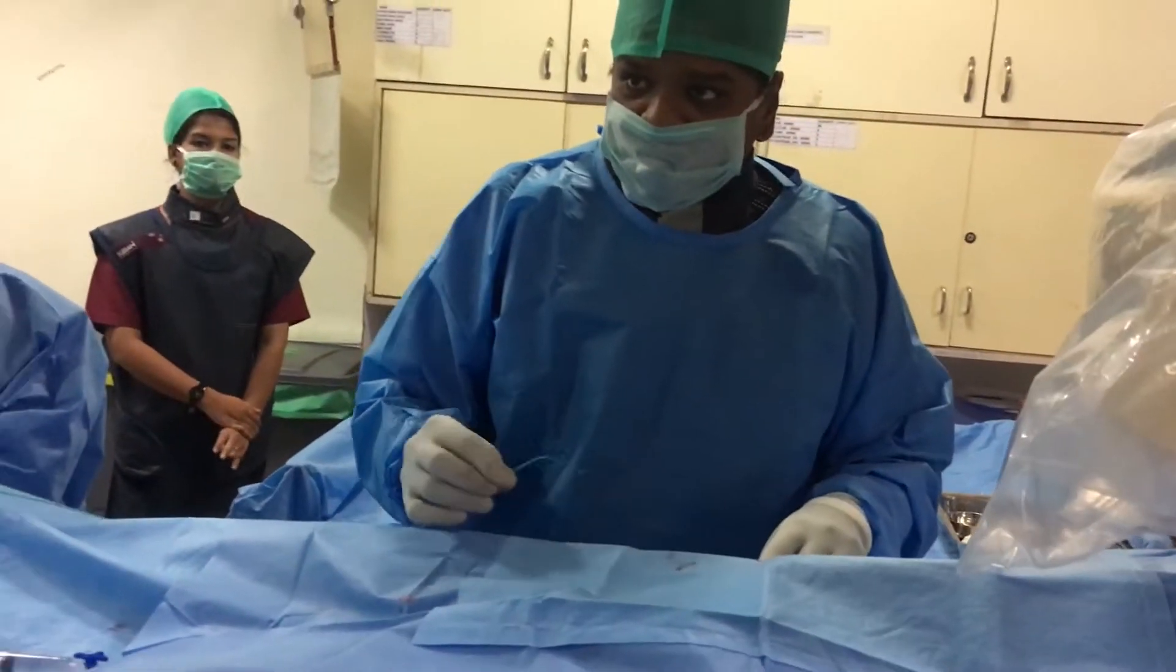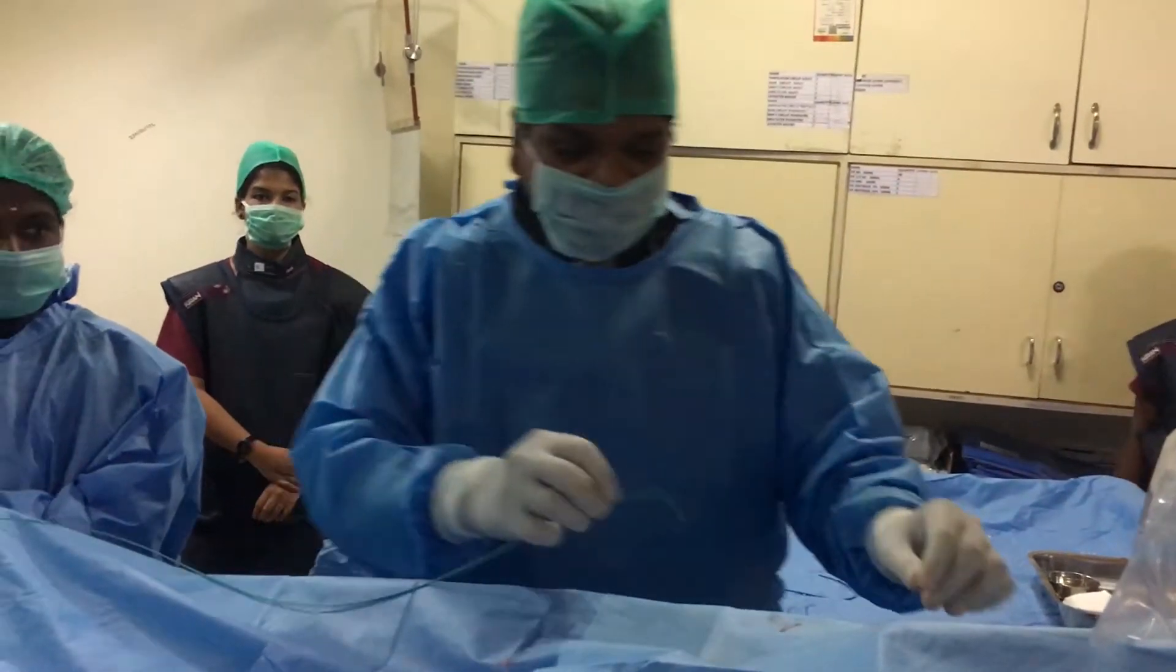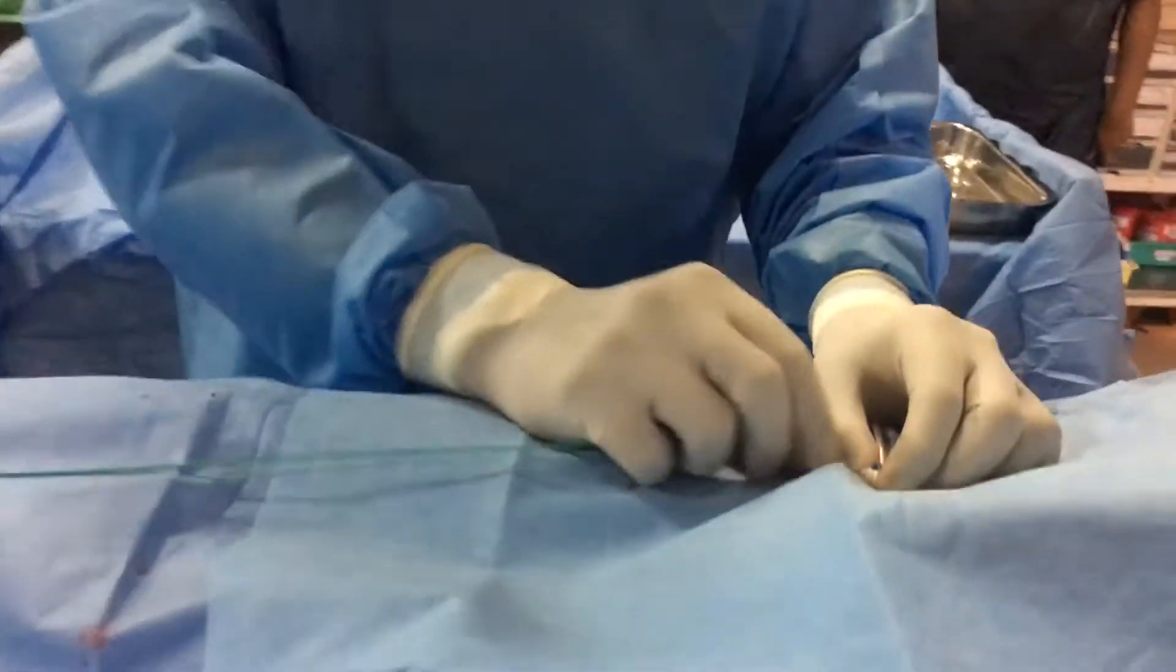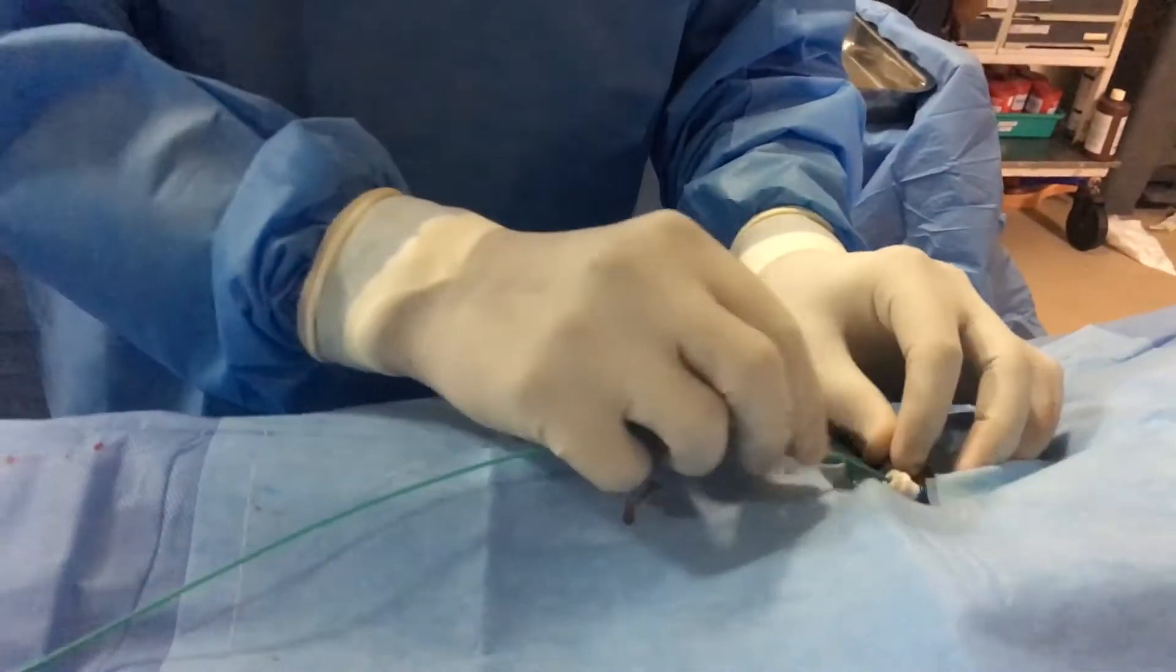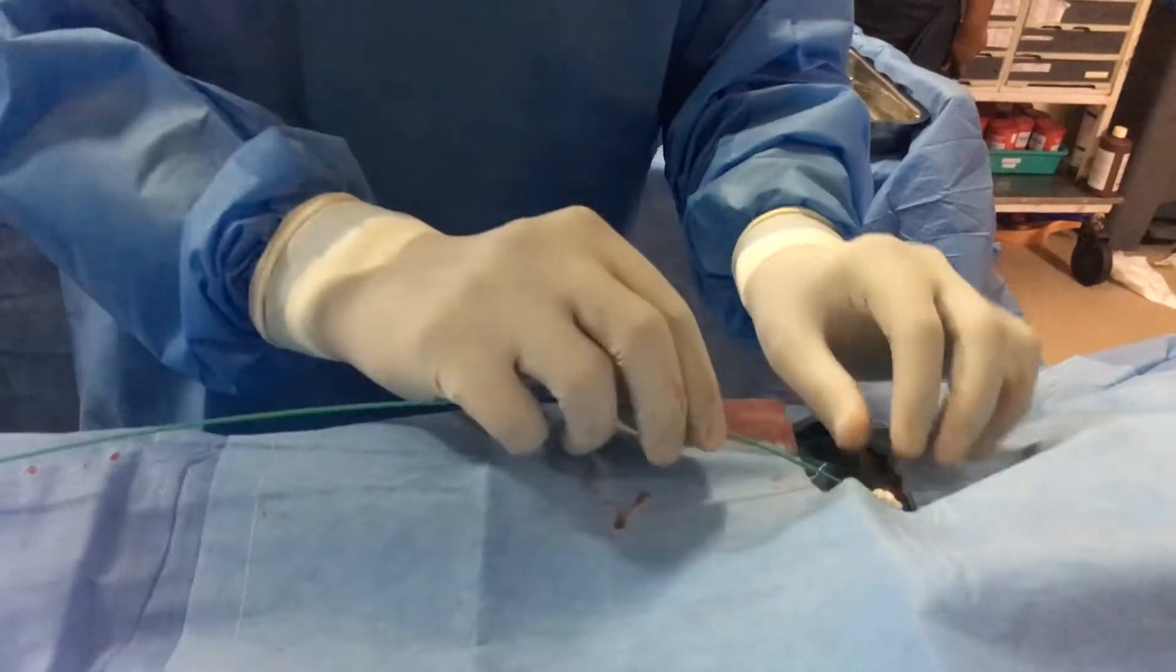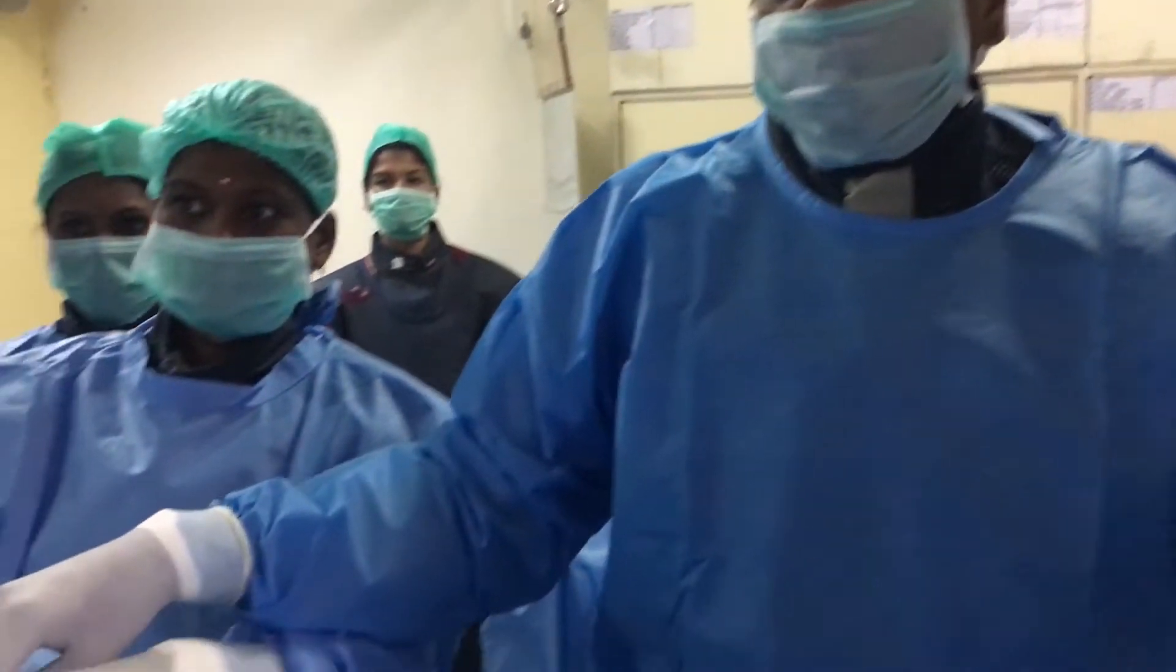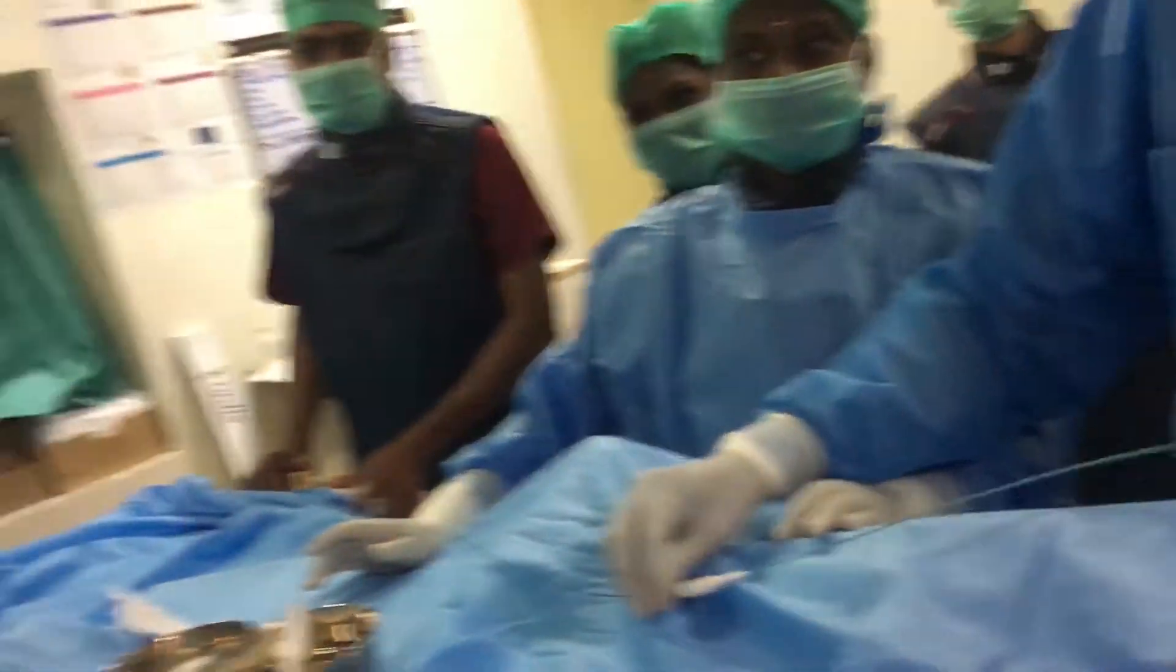So now I am going to go to the RA. So now I will be using a multipurpose catheter, this is a 5 French multipurpose catheter. Follow this, you can just move it here. So I am just taking a 5 French multipurpose catheter. Show the fluro there, focus on the front.